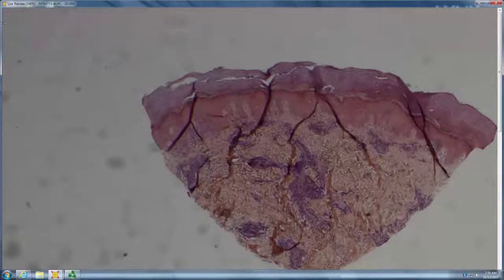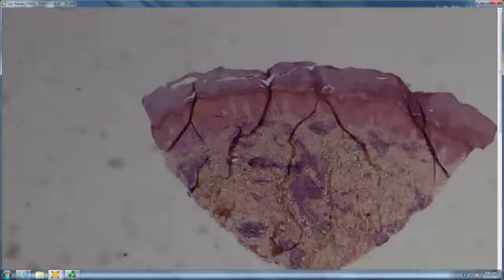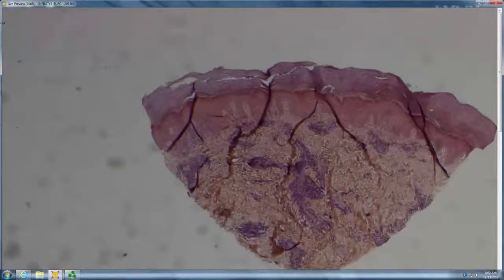There's a lot of inflammation in the papillary dermis. Can't really see much deeper than that. So papillary dermis, and then there's maybe a little bit, in this case, a little mucin probably, more than edema. And then, is the infiltrate all neutrophilic? No, there are lymphs. It's lymphoid, and the lymphs are sitting on a background of pink and overlapping, or they're sitting on a background of white and very discrete? They're sitting on a background of white. Yeah, and very discrete. Always the latter. And it is the second one.